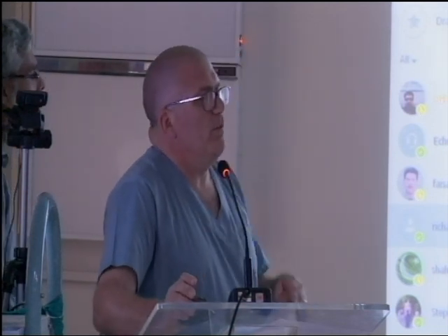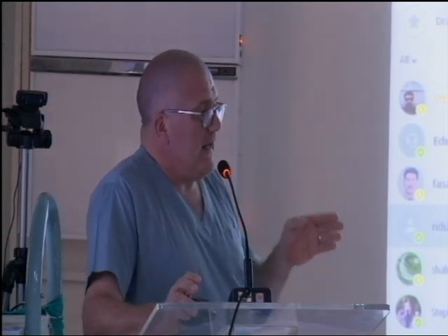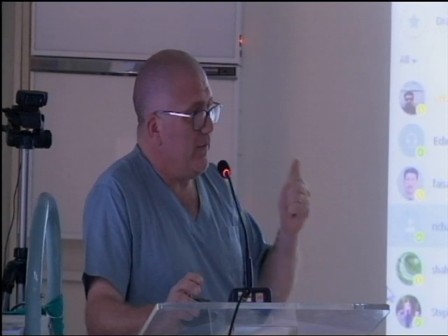This patient wanted to avoid surgery. I've got another patient who we could have done the same. He's a guy who came and he had 40 plus polyps in his entire colon. He should have had his whole colon removed. Didn't want it. He was 66, a very fit man. He had 3 colonoscopies with me in the space of 4 months. I took him in stages.